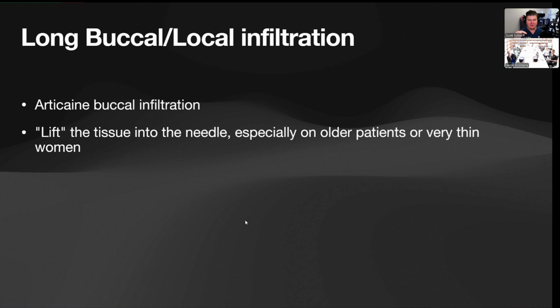And I don't know if you guys have ever done it where you're giving the injection and all of a sudden there's just anesthetic flying everywhere because it's not inside the tissue anymore. This is a great way to prevent that by lifting it up into the tissue. Does that make sense? Are you guys familiar with this concept?